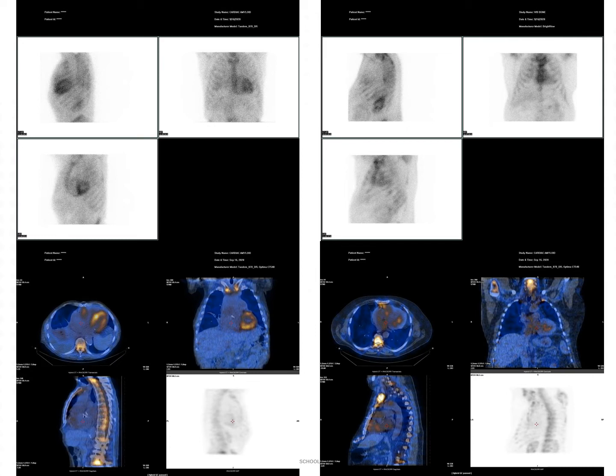This patient has a level 3 uptake at the level of the planar images, and the heart to contralateral ratio was about 2.5, confirming the diagnosis of cardiac transthyretin amyloid disease.